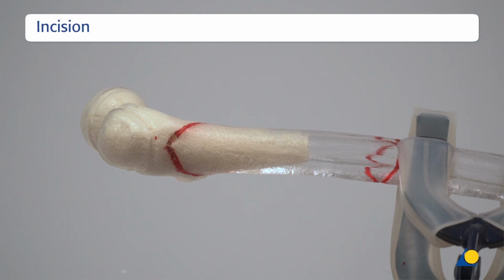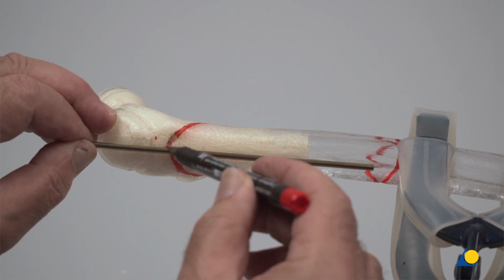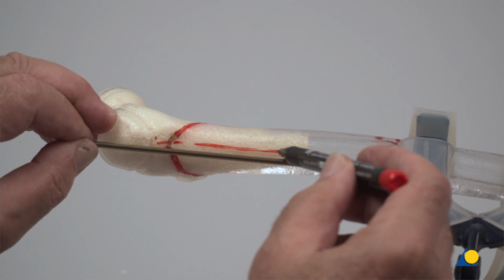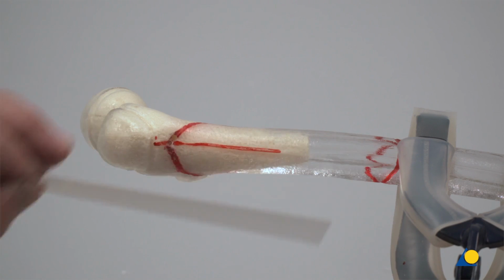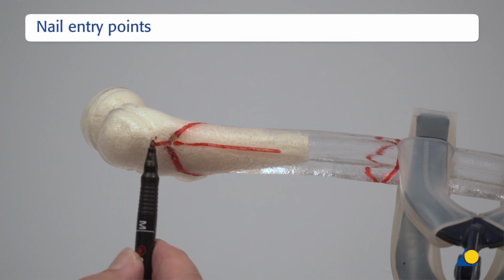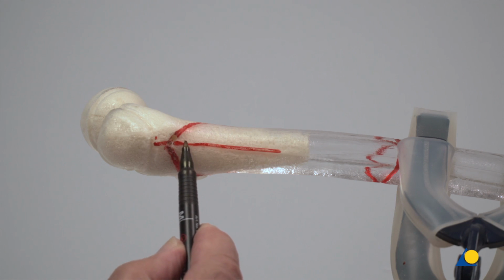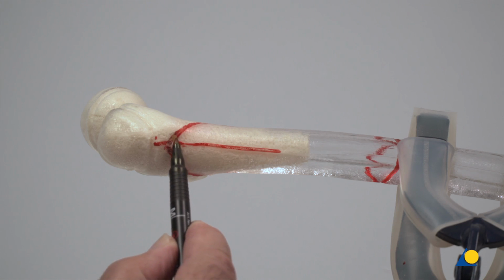The incisions are made slightly below the greater trochanter and extend distally for 3 to 4 centimeters, slightly below the lesser trochanter. The insertion point for the C-shaped nail is located laterally, in the middle of the shaft, 1 to 2 centimeters below the physis of the greater trochanter.